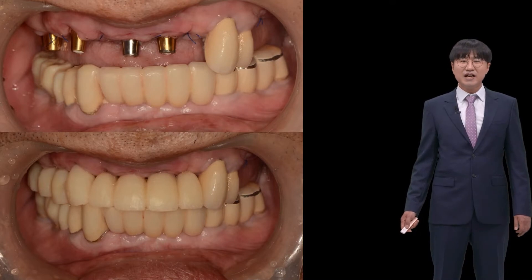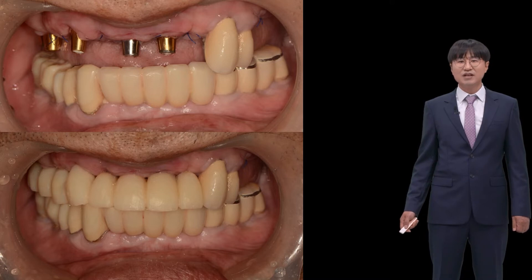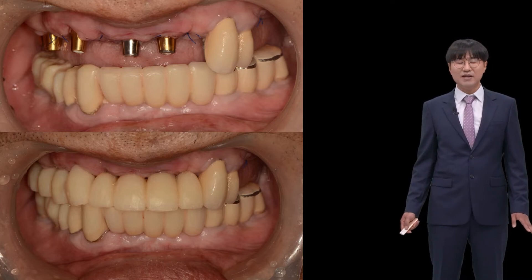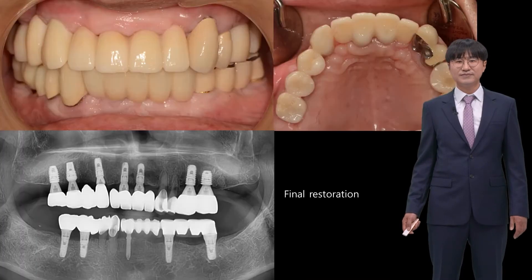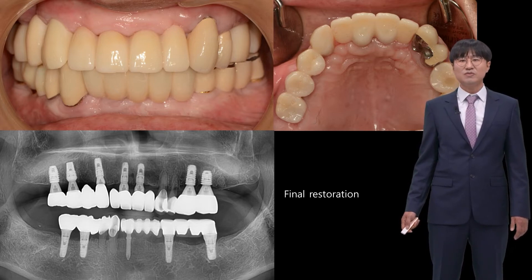The path in the posterior was different from the anterior, but a splinting effect was achieved. What is important is that the lab should be told not to high-polish the connection part before it is sent to the treatment room. If polishing is done with pumice or rouge, the resin bonding strength can be decreased. The abutments used for the temporary were adopted, and abutment-level impression was taken for the final prosthesis.